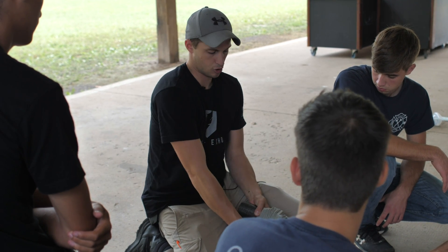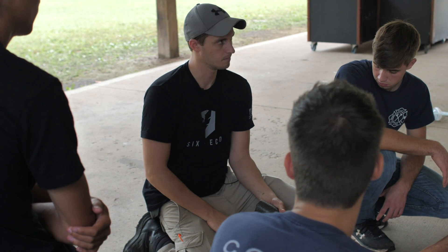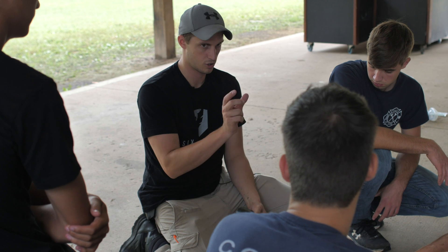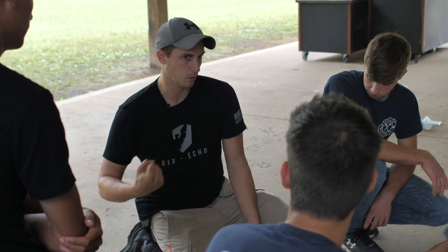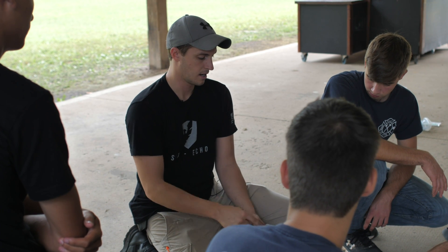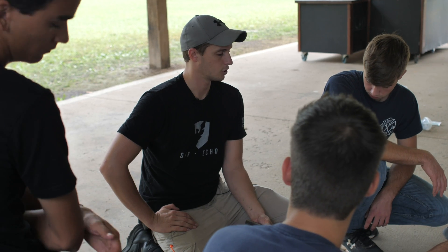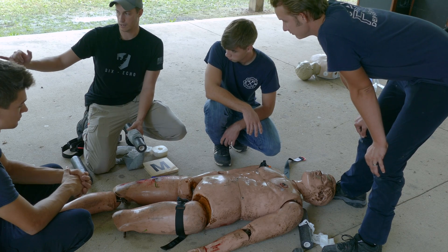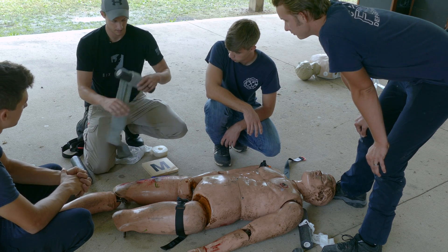When you drive that V down into the wound, it puts all that pressure right where the bleeding is. That plastic tab is just a V for pressure — that's all it is. You can loop it through, make a two-to-one out of it, pull, and get extra mechanical advantage, but really it's just that V on top of the wound. The North American Rescue ETD does not have that — it's really just a pressure wrap and you secure it with Velcro at the end.